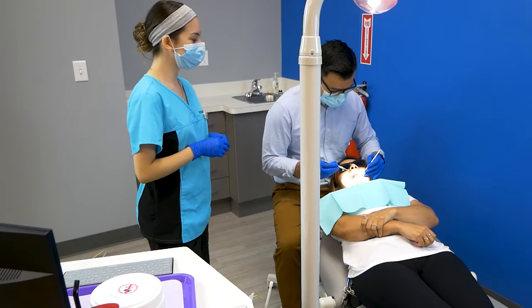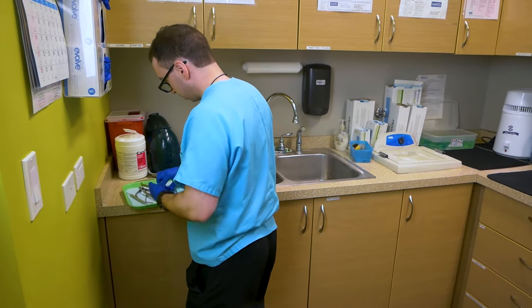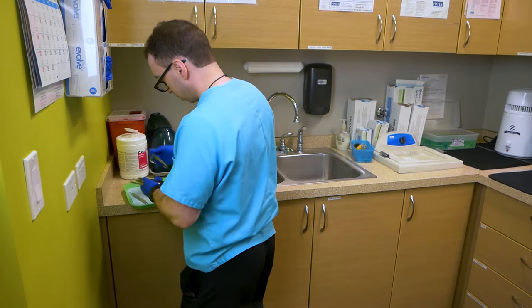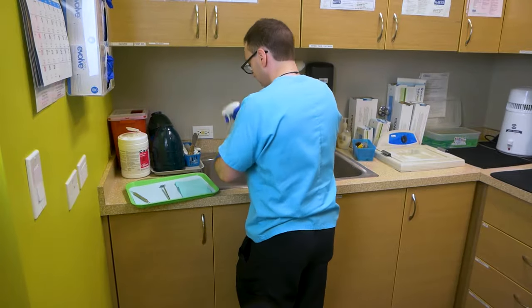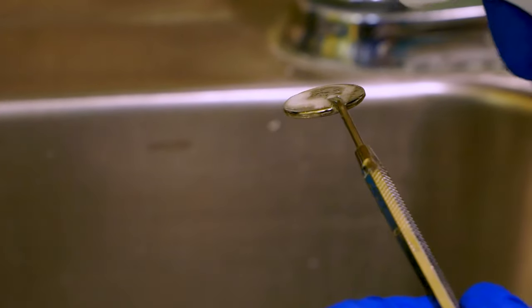The sterile tech takes the first step in sterilization by spraying the instruments with Cavicide. Then the next step is to rinse the instruments with water.